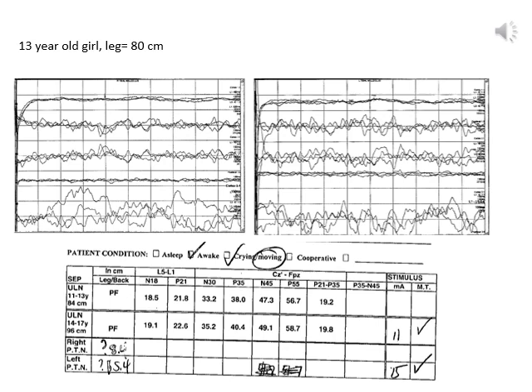And so this study is abnormal, but not abnormal due to absent cortical function. We cannot comment on the cortical responses because we do not get a good peripheral response. And so this study is abnormal due to absent peripheral responses bilaterally, with the possibility that this child has some sort of peripheral disease that is preventing the signal from traveling from her ankle into her lumbar spine.